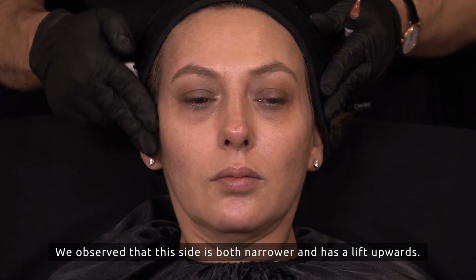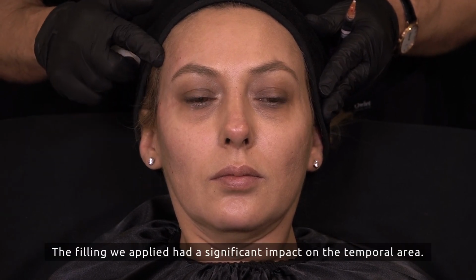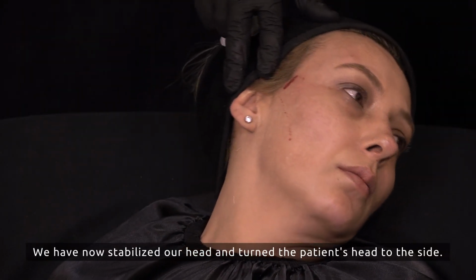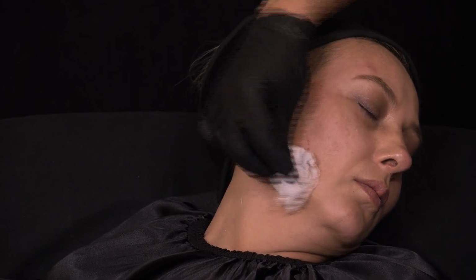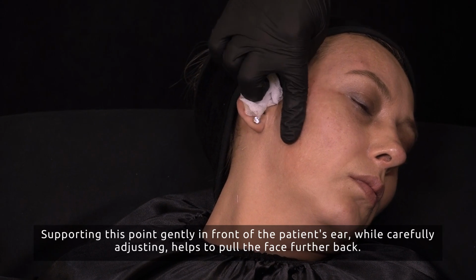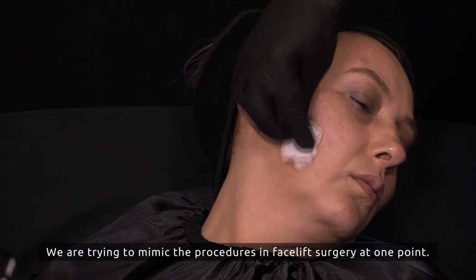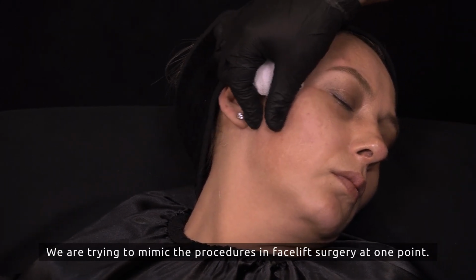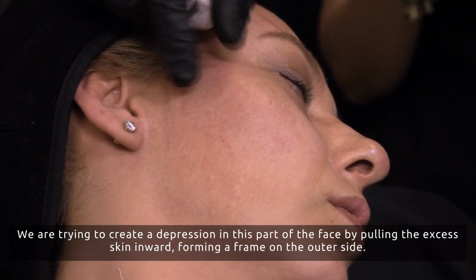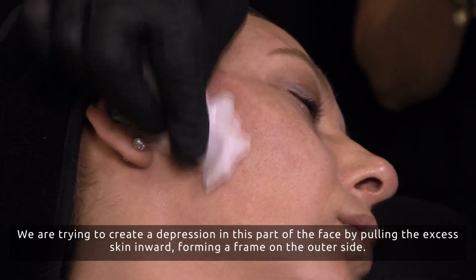We observe that this side is both narrower and has a lift upwards. The filling we applied had a significant impact on the temporal area. We have now stabilized our head and turned the patient's head to the side. Supporting this point gently in front of the patient's ear while carefully adjusting helps to pull the face further back. What are our actions? We are trying to mimic the procedures in facelift surgery at one point. We are trying to create a depression in this part of the face by pulling the excess skin inward, forming a frame on the outer side.